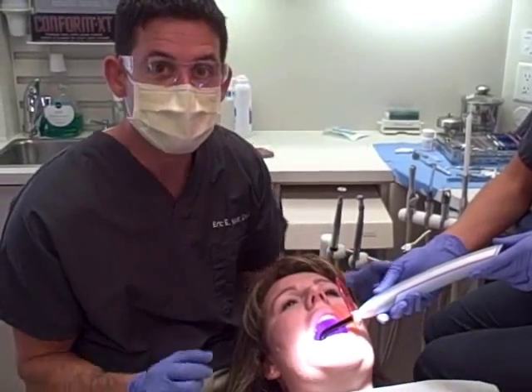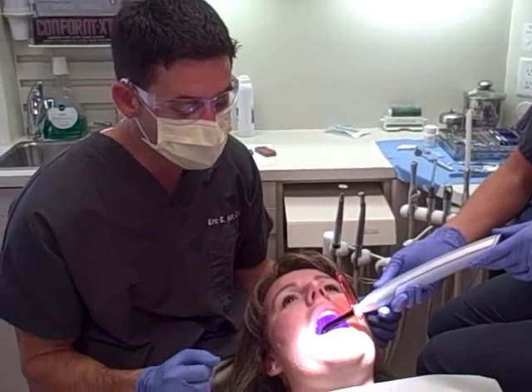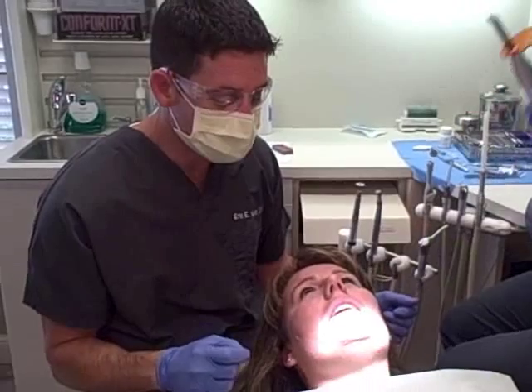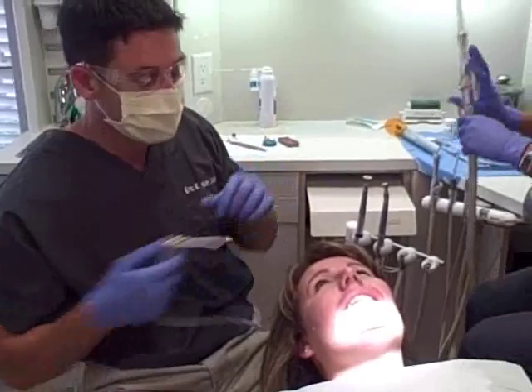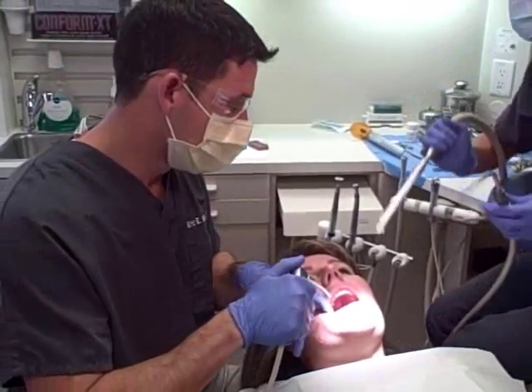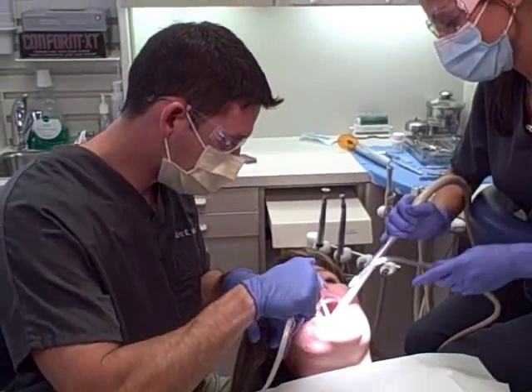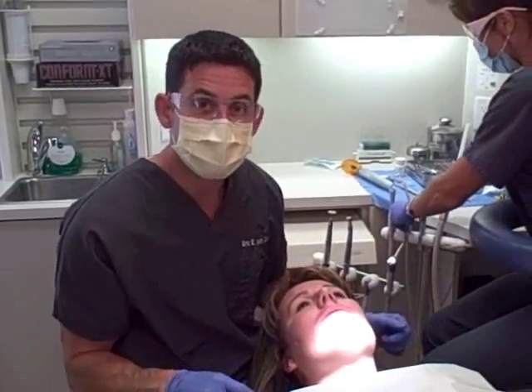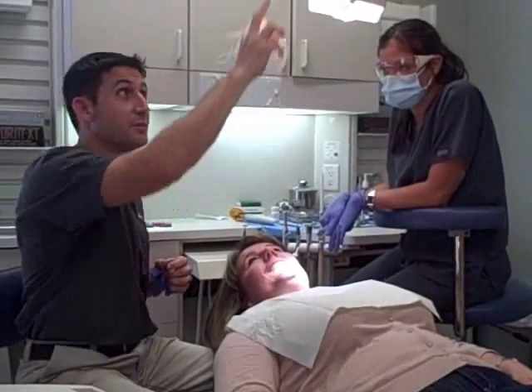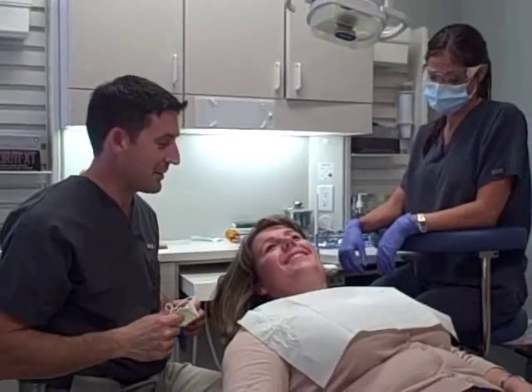We're now 40 minutes into the appointment. Her tooth is whole again in a solid piece that gives us a longevity of about 15 years. It's blended in color and shade to match specifically with her tooth. And other than just tasting a little bad at the moment, she'll be no worse for it. From here, we're going to adjust her bite, polish and finish, and she'll be ready for lunch. So we finished — 45 minutes and done. Our patient hopefully smiling, at least with half of her mouth.